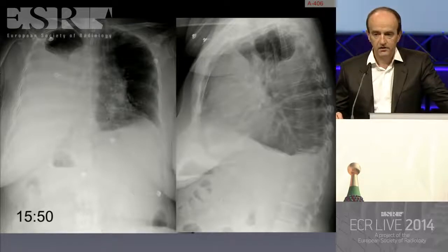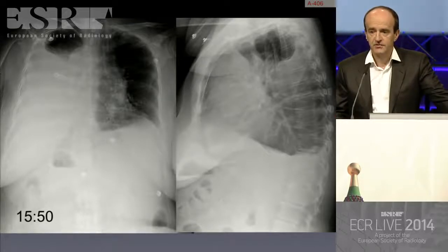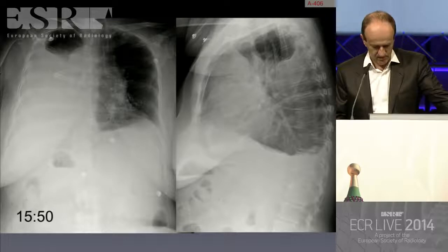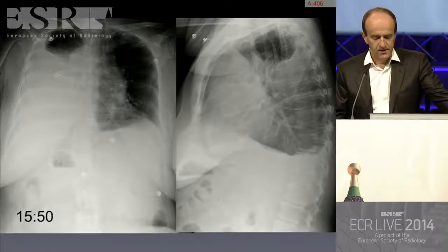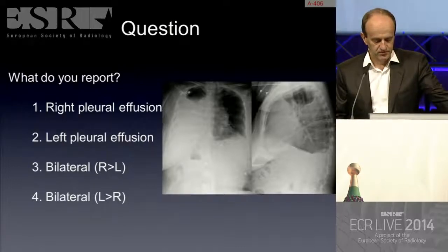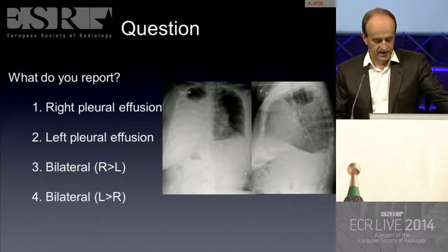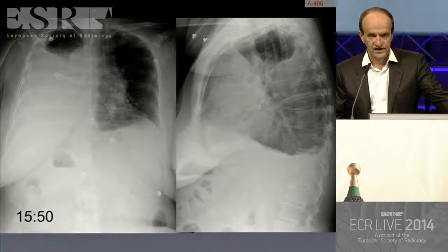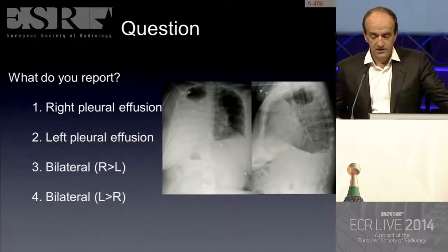Case number one: a 62-year-old woman with dyspnea and a past history of ovarian carcinoma. Here are the frontal and lateral chest radiographs. What would you report? A right pleural effusion, a left pleural effusion, bilateral right larger than left, or bilateral left larger than right? Please vote now.